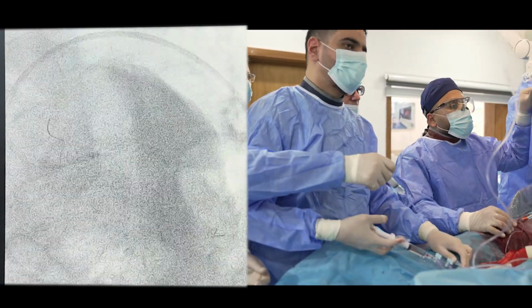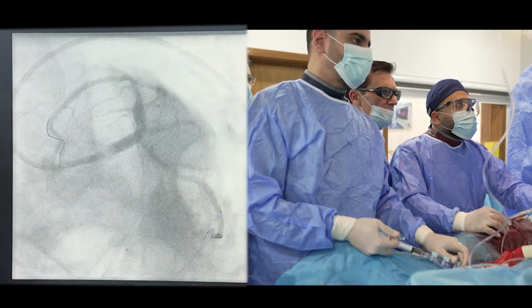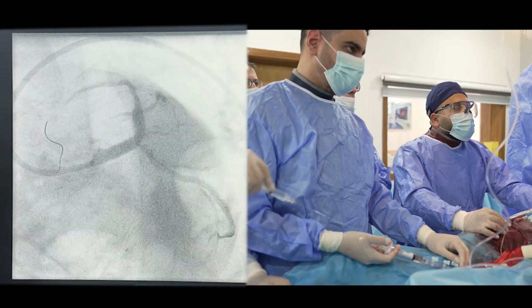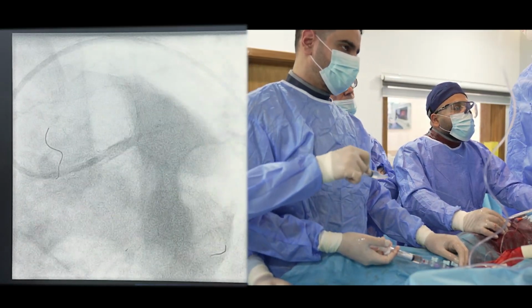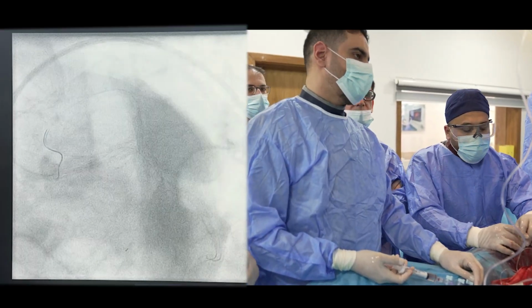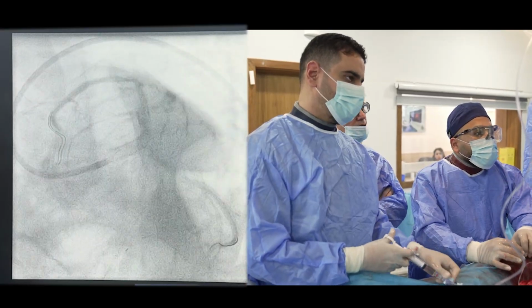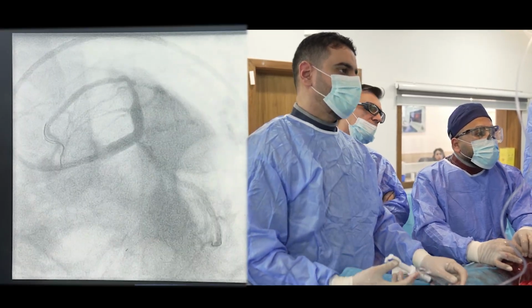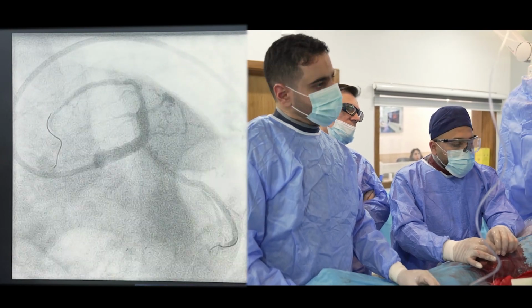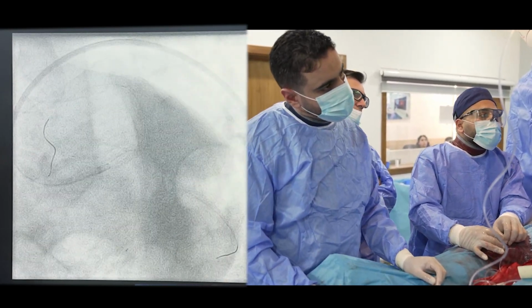Okay. Angio. Yeah, maybe we need to put a stent, huh? What do you say? Yes. Possibility of dissection. Yeah, there is some dissection. It's no problem, but we feel more comfortable if we do a T-stenting, huh?